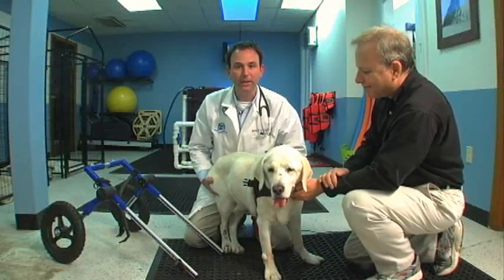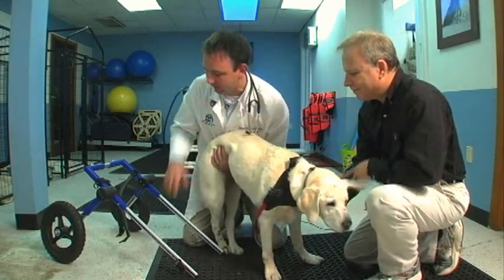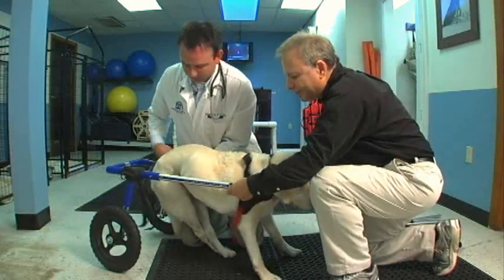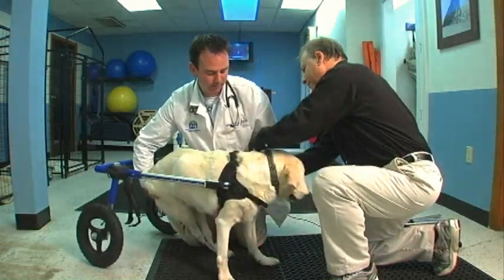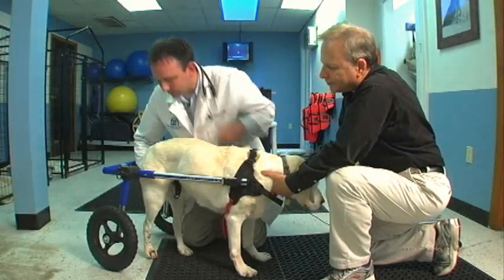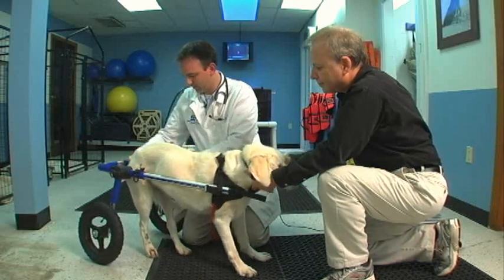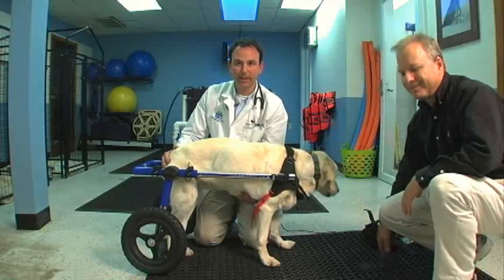So I'm going to have Mark help me get Sonny into the cart. And what I want to do is show you two different ways of doing it. The first way is you can take the leg rings and detach the front of them. And then we can bring the sides of the cart up. I'm going to support Sonny's back end while Mark is going to clip on the front. Once Sonny's in on the front, you can take the leg rings and clip them into place. Like that. And Sonny's sitting in the cart perfectly.